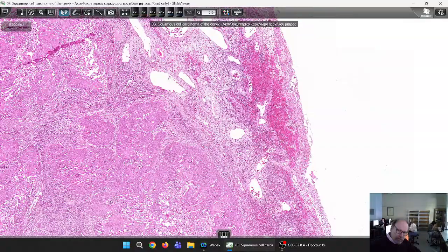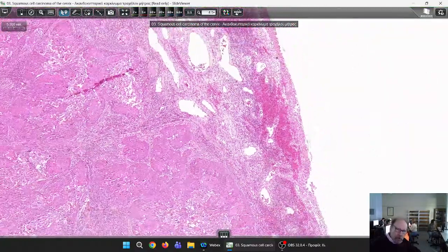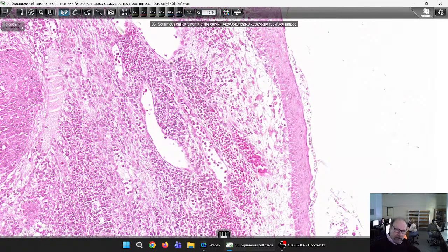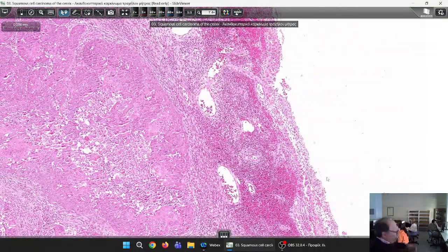And furthermore, have a look at what has happened to the superficial mucosa. Look, are there any squamous cells here? No. There is an area of hemorrhage. Look here. Here you can see the mucosal squamous epithelium with all its layers, stratified epithelium, and here you do not see the epithelium. So what has the cancer caused as regards the surface epithelium in this slide? Since you see that there is destruction of the covering epithelium, yeah, an ulceration.